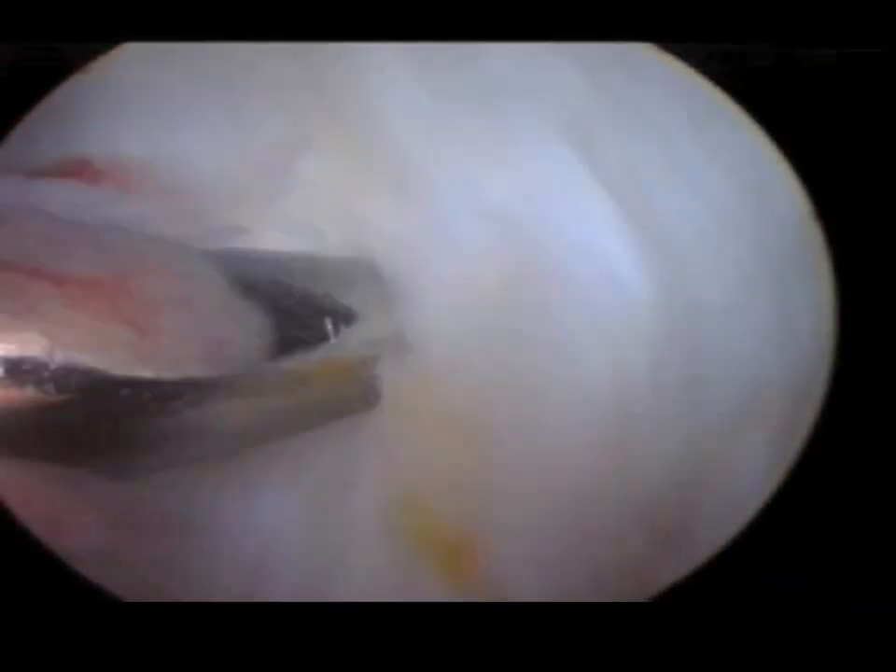This is the bulk of the ligament, and this is a ligament that is progressing and beginning to degenerate. You can see the fibers now are loose as we push on them with a probe.